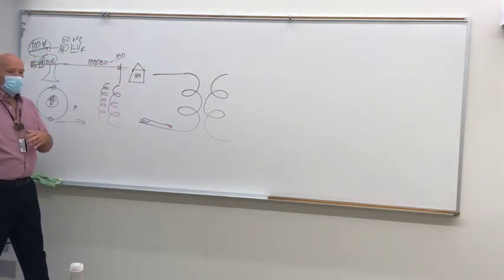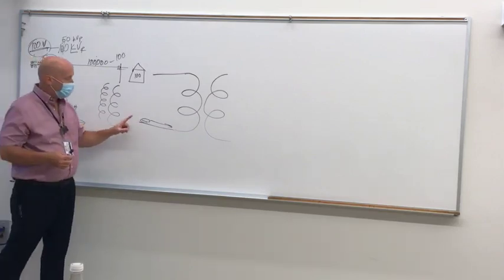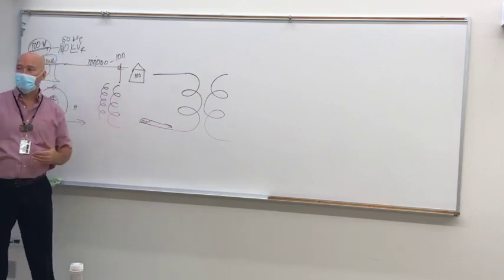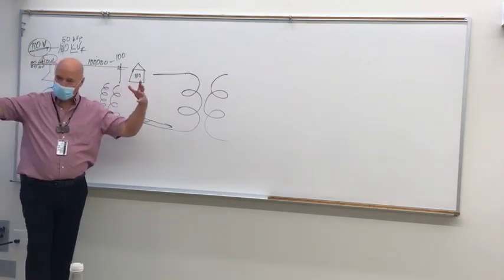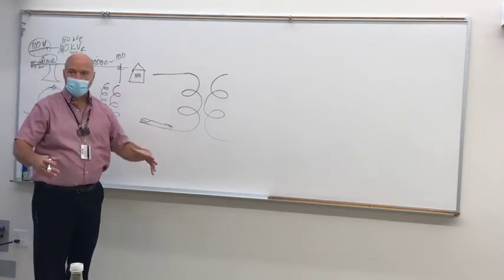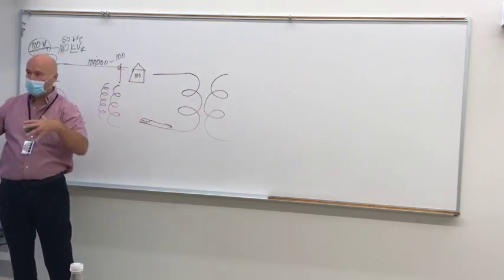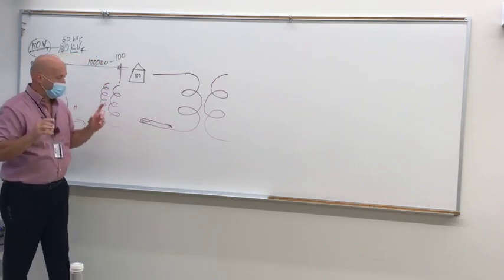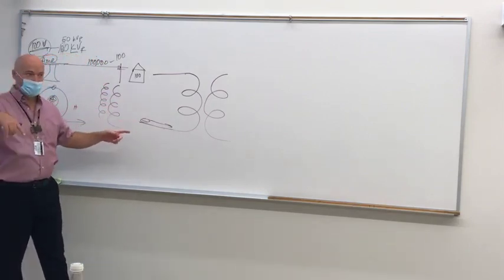Now, because of the laws of electromagnetism, anytime we have a charged particle moving through a circuit, we create a magnetic field. Have you seen in a junkyard the way they take a great big magnet and stick it to the top of a car, pick the car up, and then drop it into a crusher or a shredder? The reason it can do that is it's a magnet that you can turn on and off.